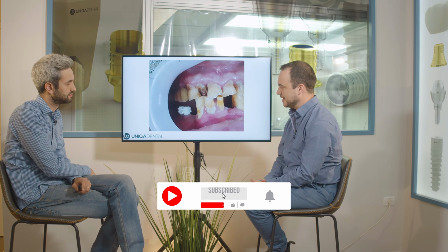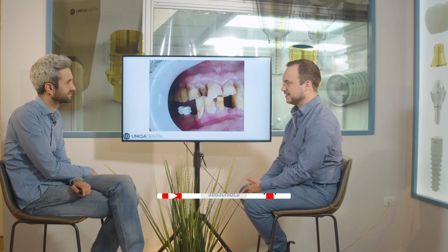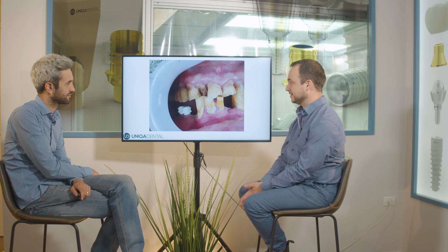Today we brought a super old case of ours that was made many years ago, even before the intraoral scanner era. In this case, we had a patient with a couple of implants on both sides, and probably a problem with all of his teeth. So we need to make some kind of restoration in the frontal area, designed and done with the oldest technologies that we had.